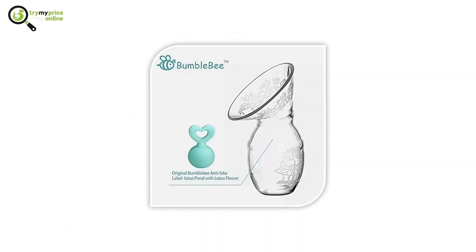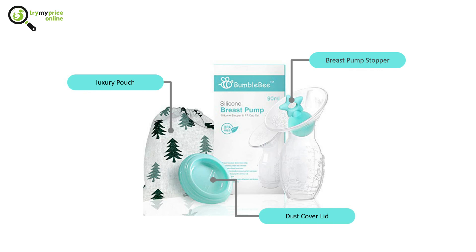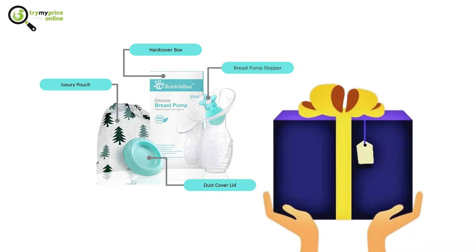Number 6: Bumblebee Manual Breast Pump. This manual breast pump is lightweight. It comes with one breast pump suction cup, a dust cover lid, and one luxury pouch. The quality hardcover box makes it perfect as a baby shower present for a new mum.